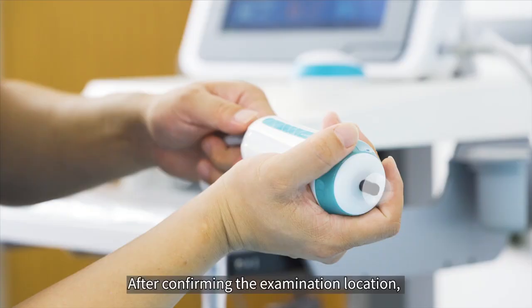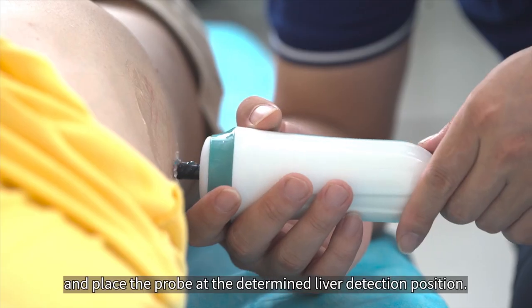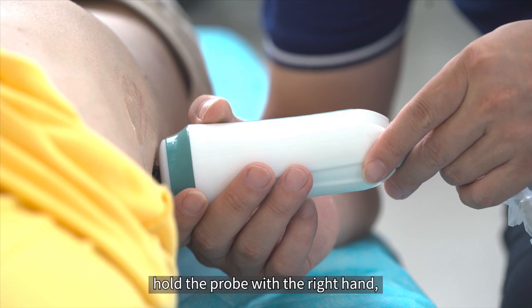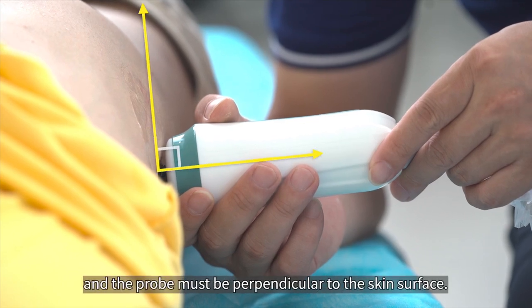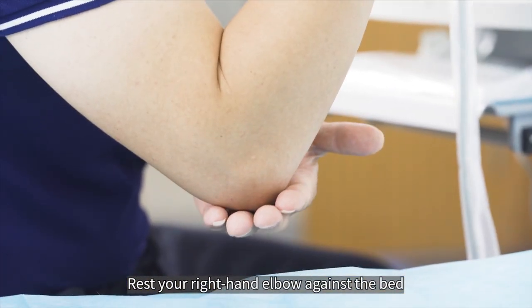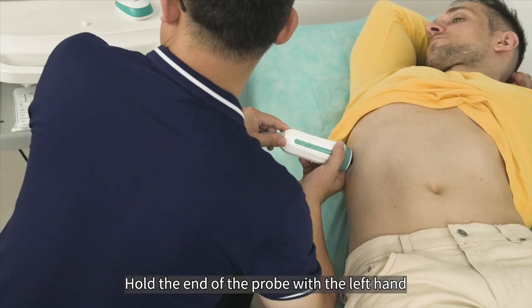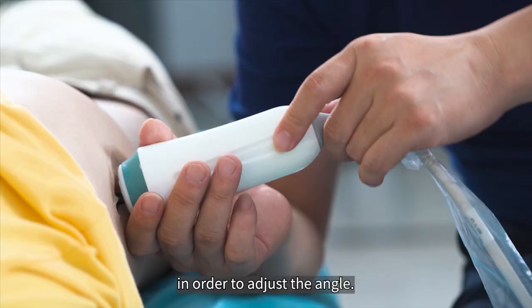After confirming the examination location, apply a proper amount of coupling gel on the surface of the probe and place the probe at the determined liver detection position. Hold the probe with the right hand, make it close to the skin, and the probe must be perpendicular to the skin surface. Rest your right hand elbow against the bed to prevent the probe from sliding. Hold the end of the probe with the left hand in order to adjust the angle.